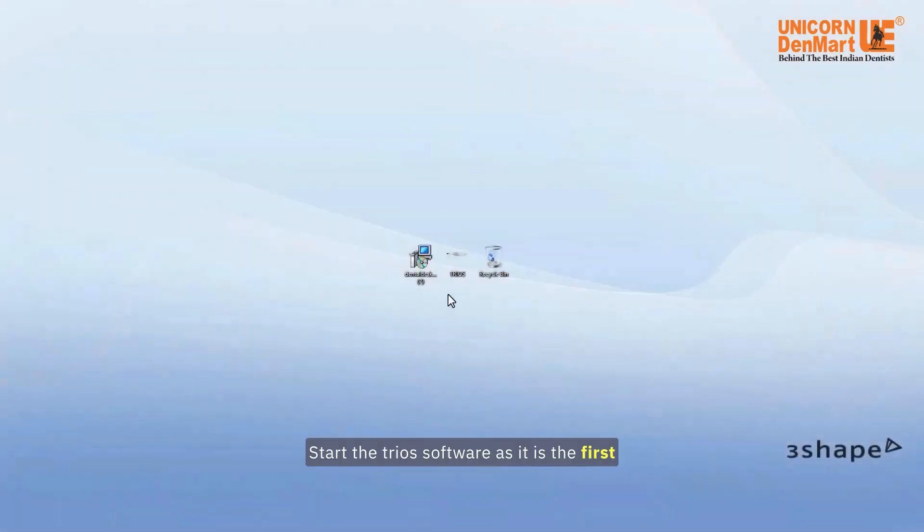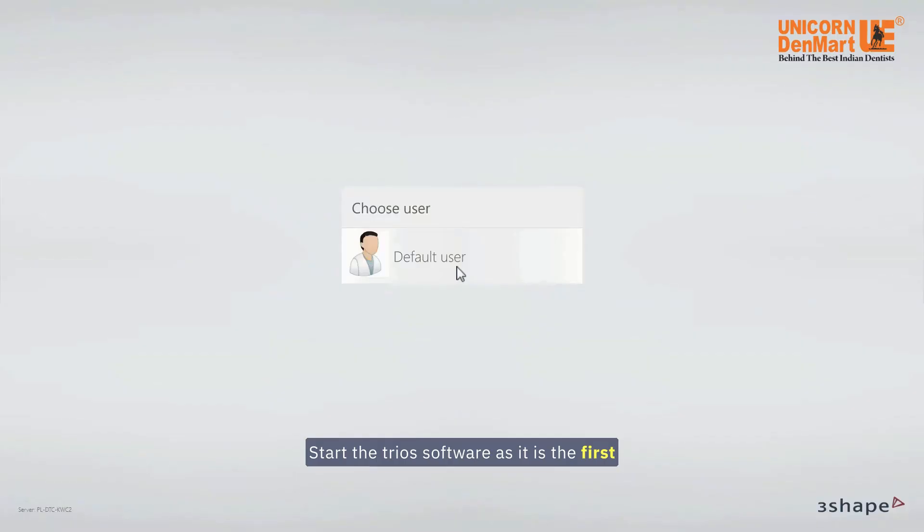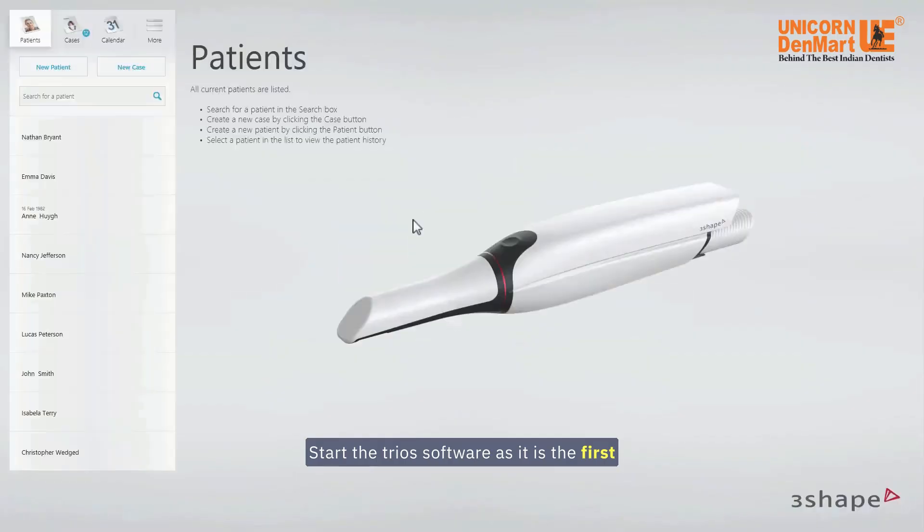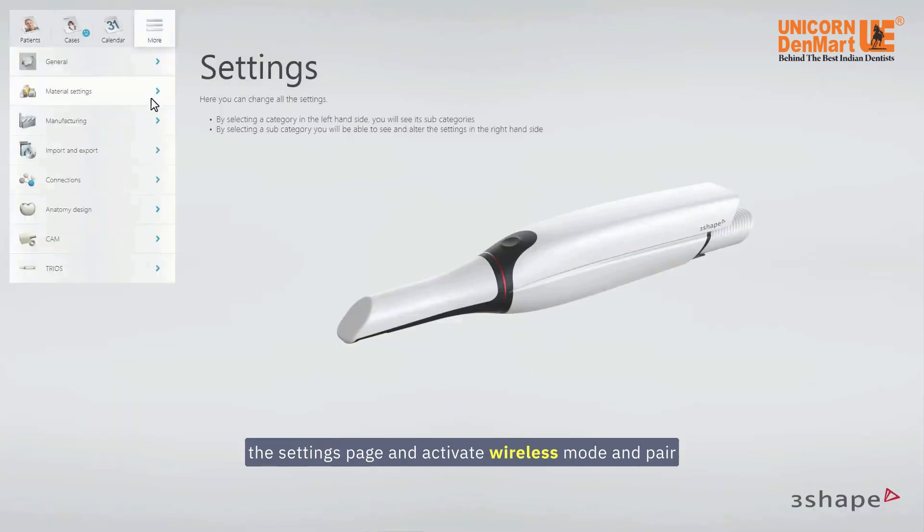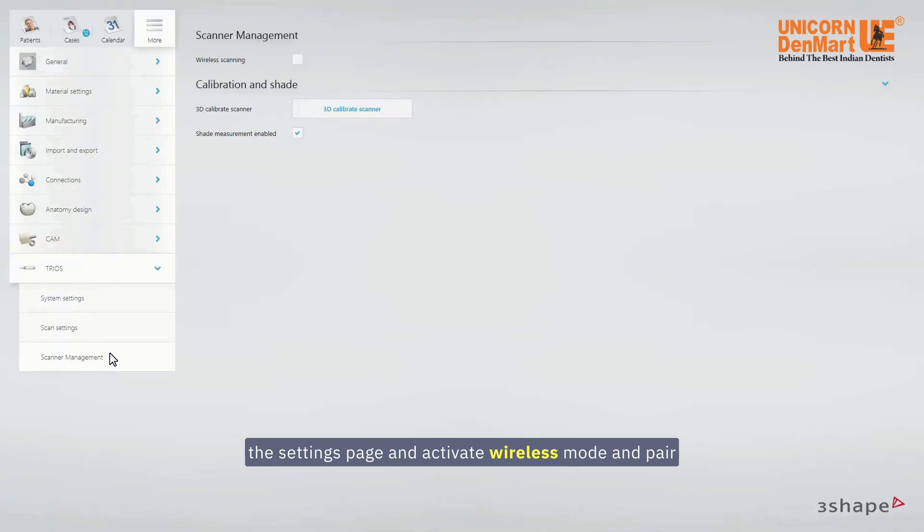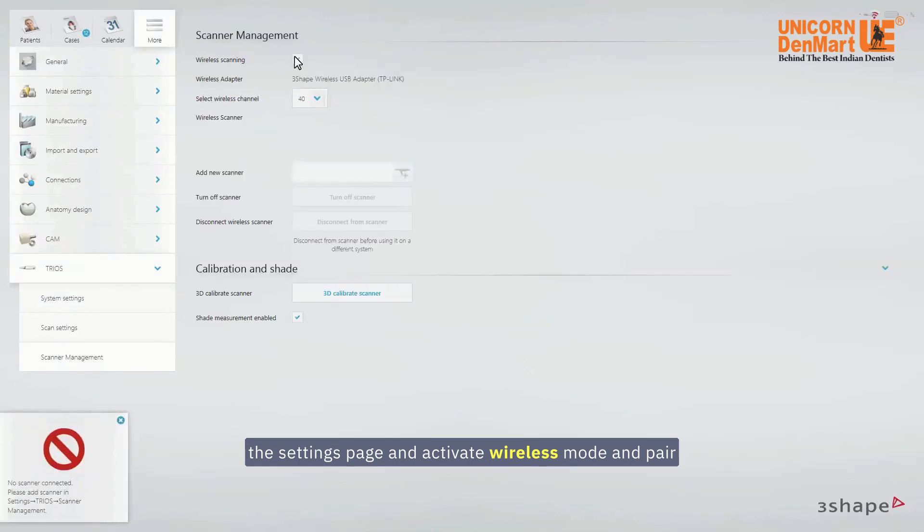Start the TRIOS software. As it is the first time of use, you will need to go to the settings page and activate wireless mode and pair the scanner with the software.